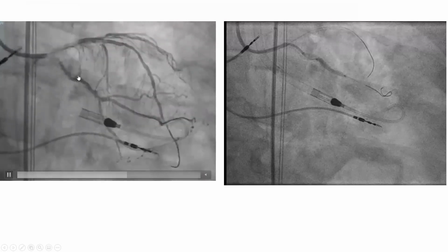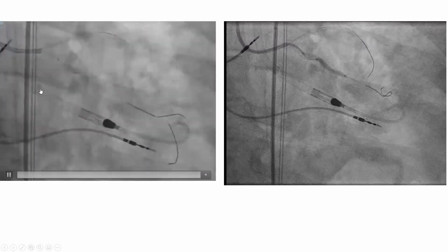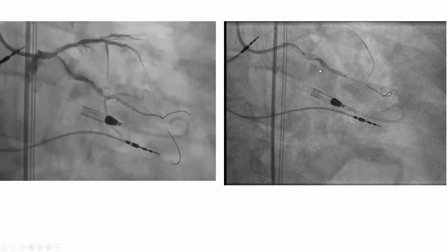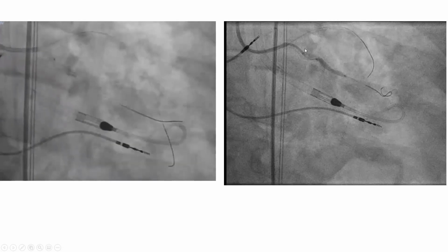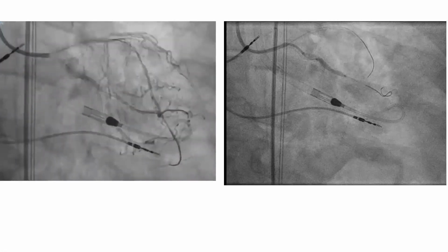And this is where they got into hemodynamic trouble. It was difficult to advance that stent in the circ across the calcified left main. So they had to put a guide liner through the left main into the circ. They had to do a lot of maneuvers to deploy a stent in the circ. And in that process, they caused ventricularization of the guide and the guide liner, and they caused prolonged left main ischemia.